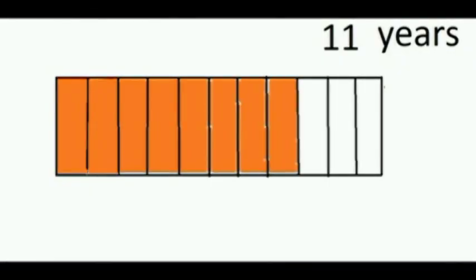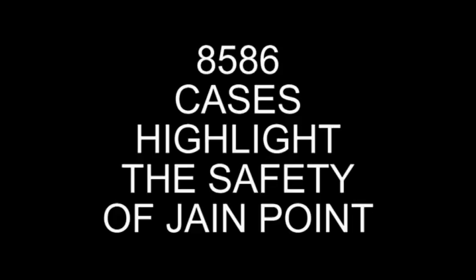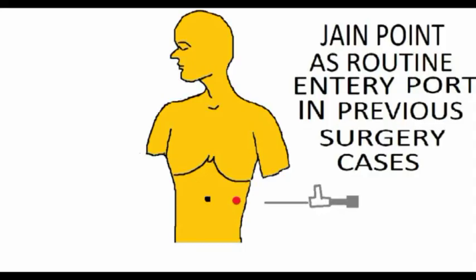General and neurosurgeons also have used this point as a camera port or working port in the course of surgery. The result of this study, spanning 11 years and 8,586 cases, highlights the safety of Jain point as a routine entry port in previous surgery cases.